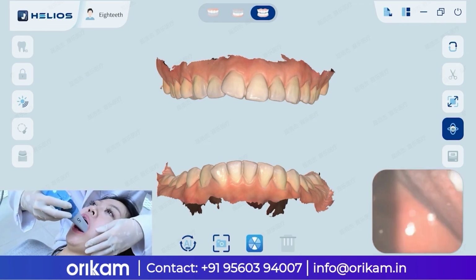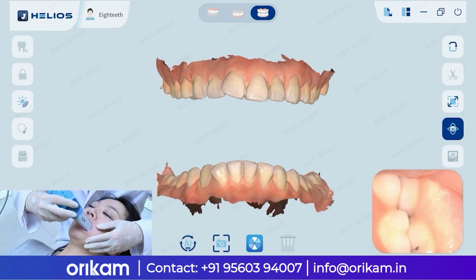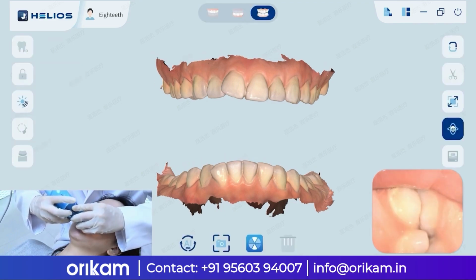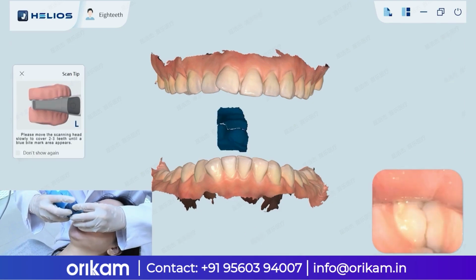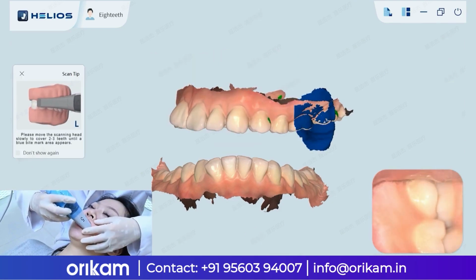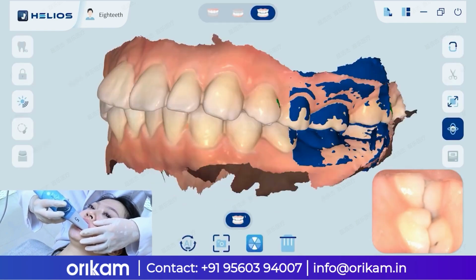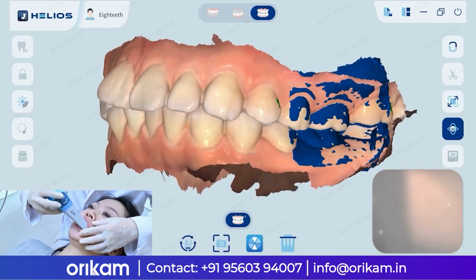Have the patient open their mouth wide, place the scanner head on the buccal side, push aside the buccal mucosa, and then have the patient bite down firmly. Move the scanner in an S-shaped pattern over the patient's teeth, scanning the posterior teeth until the occlusal scan is complete.